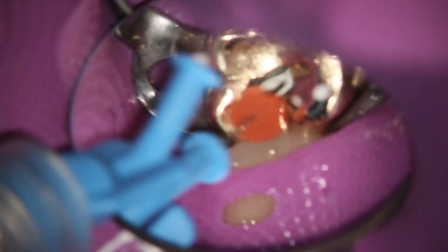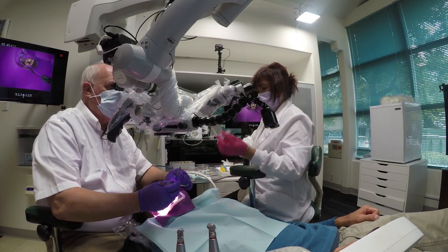So this seems to me to be a very efficient way to do it. Here's the calcium hydroxide with the stopper measured, and we inject the calcium hydroxide. And then we'll just put a glass ionomer over the top of that.